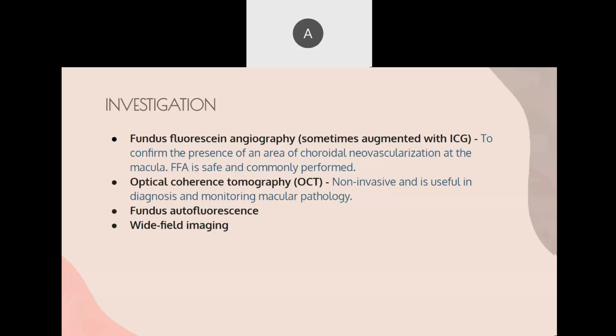We do it ourselves. So we inject a dye, and then we use the same machine as the OCT. We take many pictures, we see where the dye goes, how the vessels appear. Okay, I would consider fundus fluorescein angiography in all cases of macular degeneration, especially wet AMD, must do.